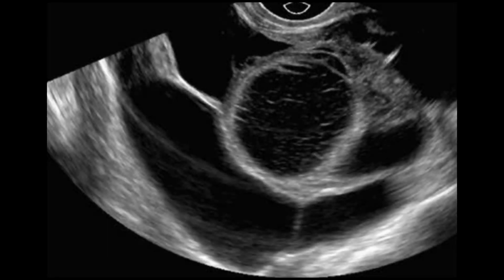This is a transvaginal image and it shows a multilocular cyst with linear septations attached to the right ovary that project within the structure and contain a hemorrhagic cyst. It is clearly visualized that this is the right sided ovary and it contains a hemorrhagic cyst. You can appreciate a small, tiny reticular pattern within the cystic lesion. This represents adhesions attached to the right ovary. In the surrounding area you can see thick septations, and these septations are suggestive of an adhesion pattern.